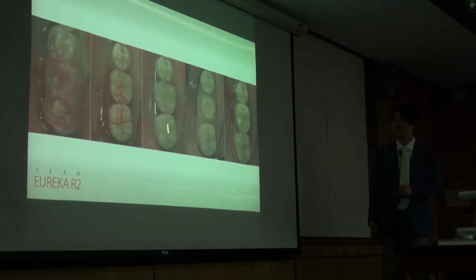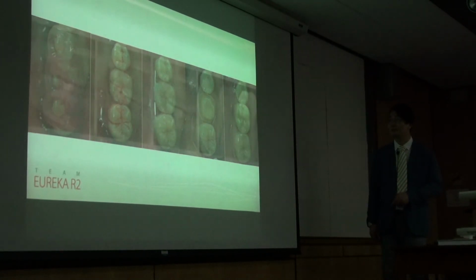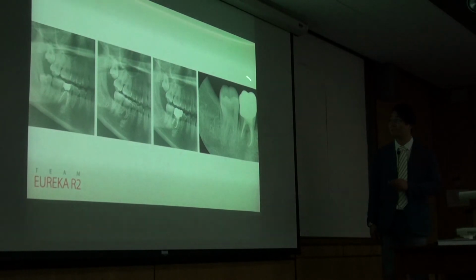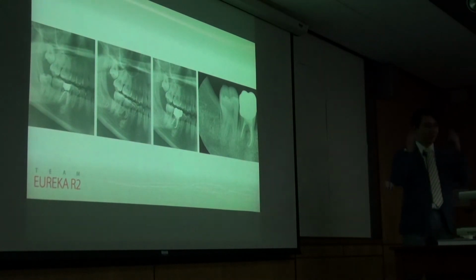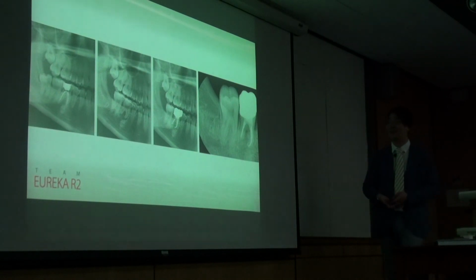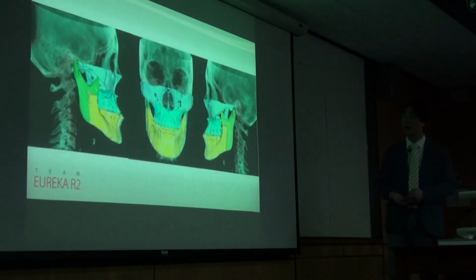And with the connection, after the endodontic treatment, make the natural crown like this. So using RK, not only implant dentistry, we can do everything. This is the thinking of the digital era. How about this?